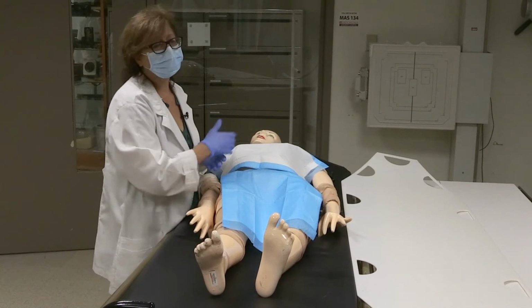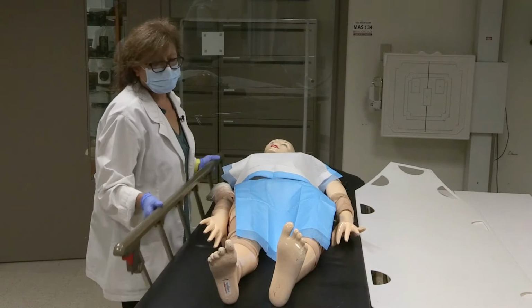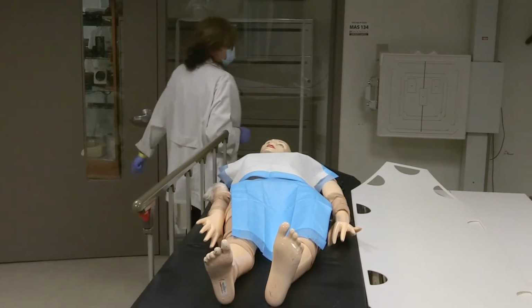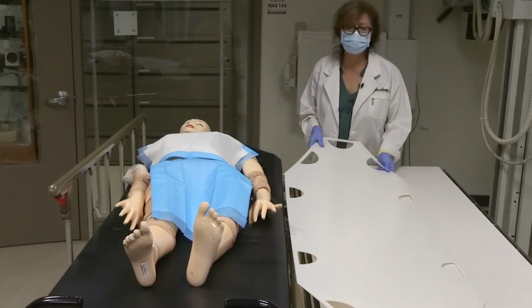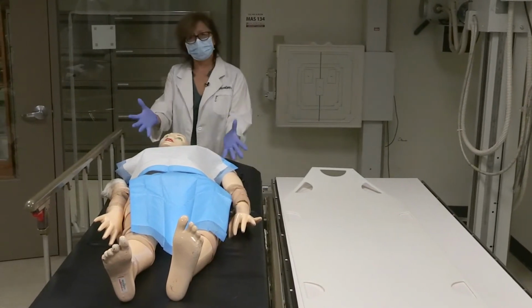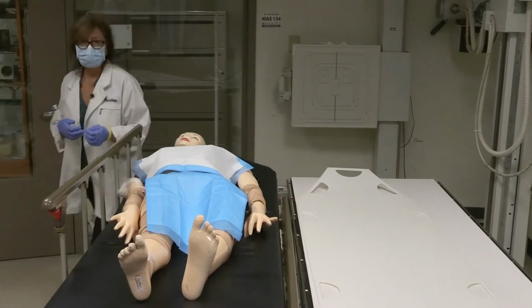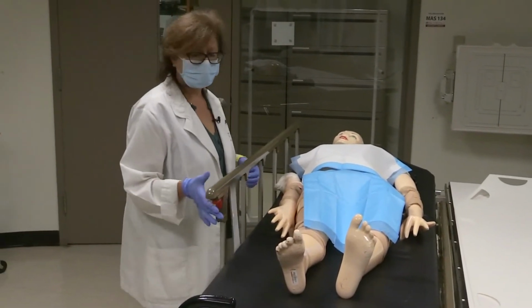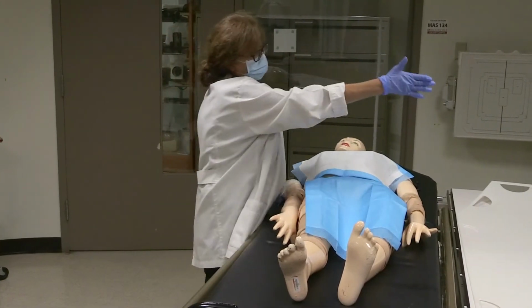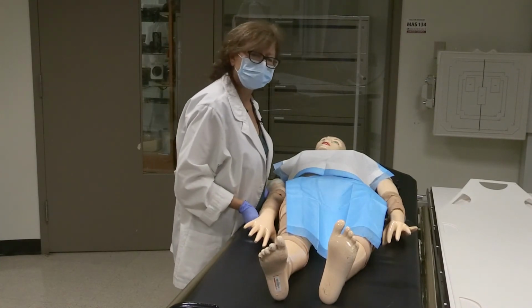The same process would apply for when the patient is coming back. The other method of moving a patient is just using the sheet. So instead of using the sliding board, we would all grab the sheet really tight and close to the patient on all 4 sides. And again, the more people that you can get to help, the better. I would be on this side, somebody will be opposite from me, and one other person at the end. Everyone's going to grab the sheet really tight.